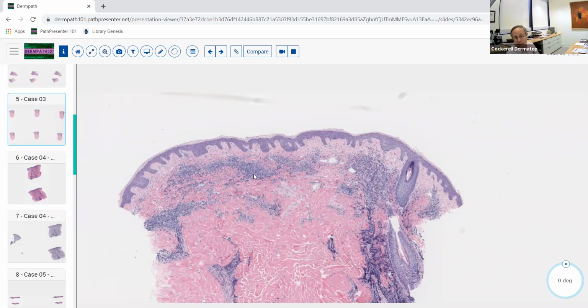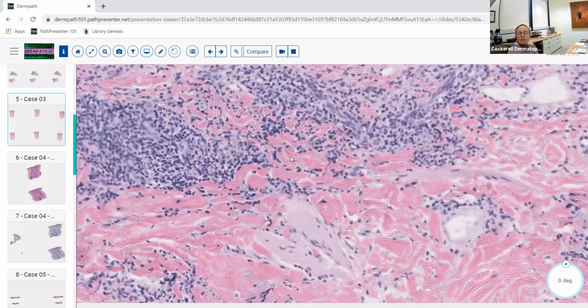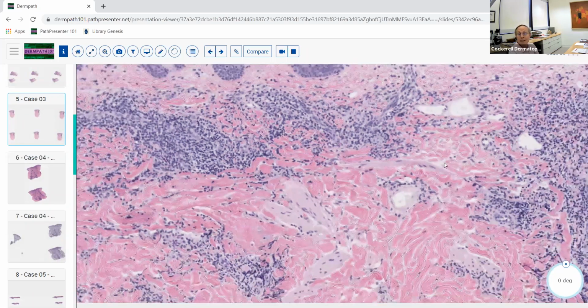So we put leprosy in the L's as well. But this is an example today of a bacterial infection. So it's got a superficial and deep infiltrate with lymphocytes and some plasma cells. Obviously, you think about Lyme disease, and that's erythema chronicum migrans caused by Borrelia.